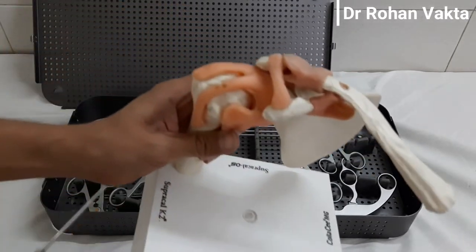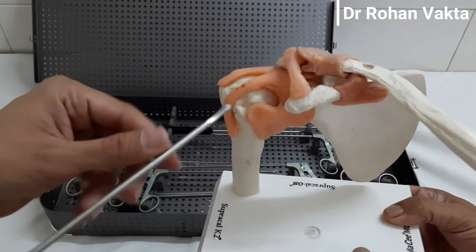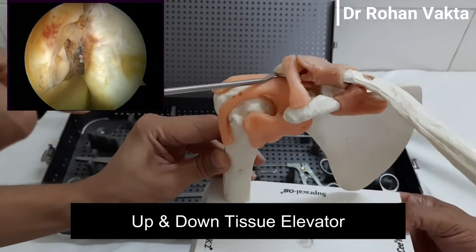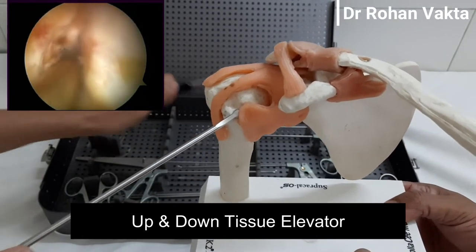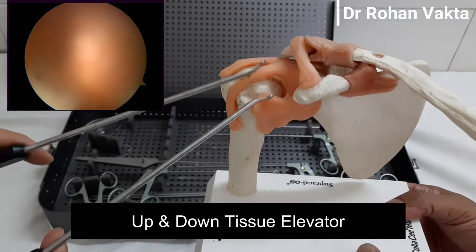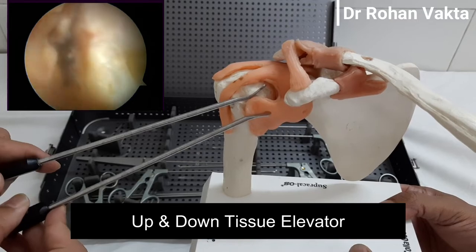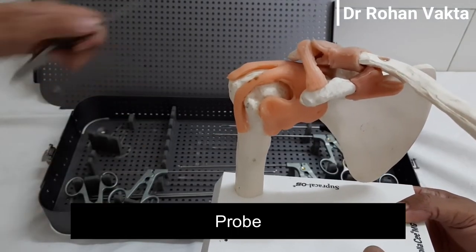These are tissue elevators, also known as tissue liberators. Similar to the upward and downward rasp, there are upward and downward elevators. They are used to remove fibrosis and for better mobilization of soft tissue. These are used in Bankart repair, SLAP repair, and rotator cuff repair for mobilization of the cuff tissue or the capsule labral tissue.